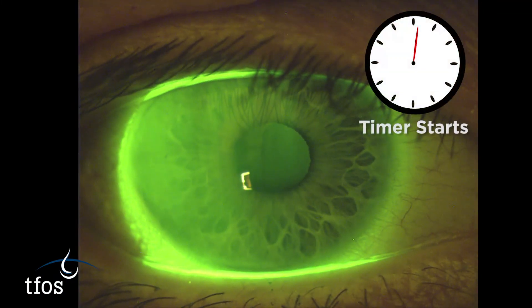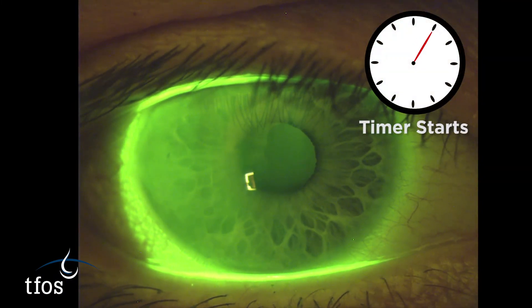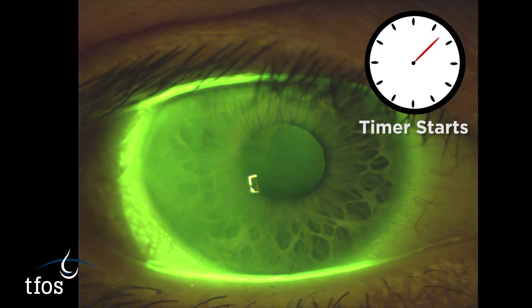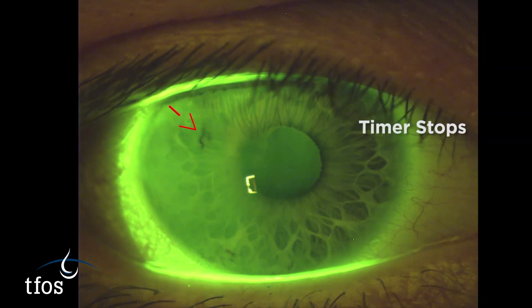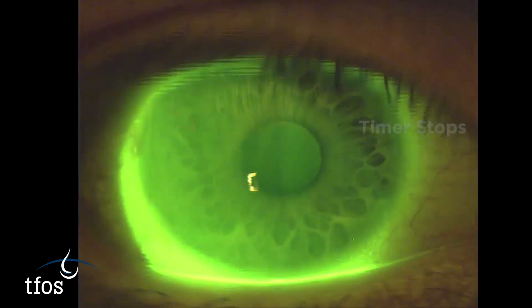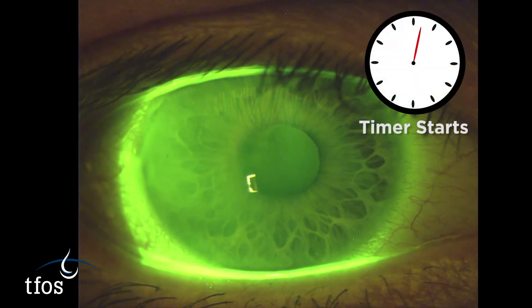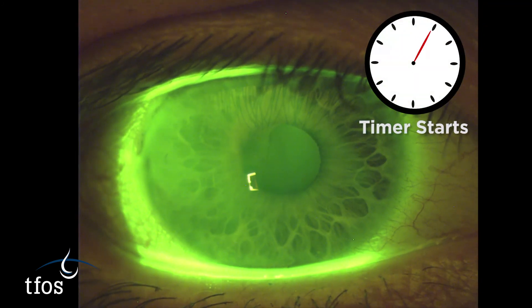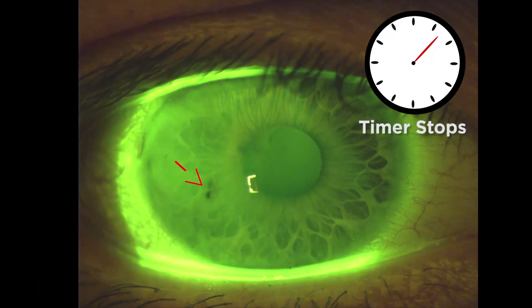The time taken between a blink and the first appearance of a dark spot, as indicated by the arrow, is recorded. And again, due to the variability in the measurement, three recordings are generally averaged.